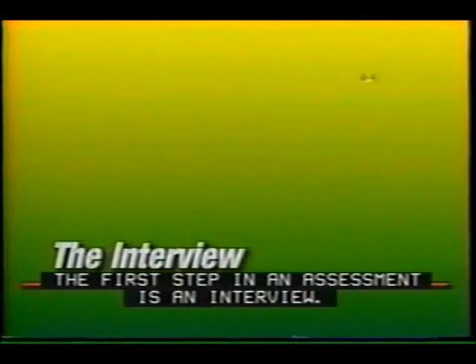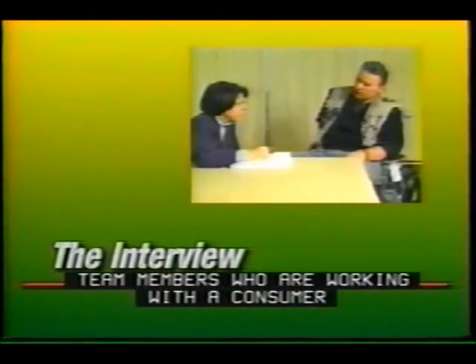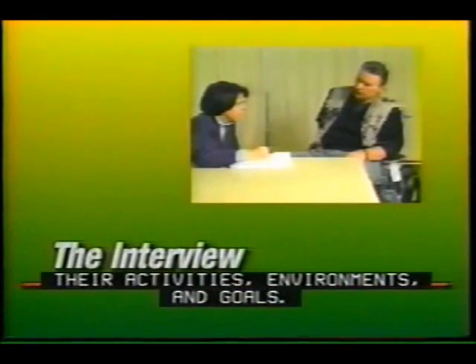The first step in an assessment is an interview. Team members who are working with a consumer need to get to know this person, their activities, environments, and goals.